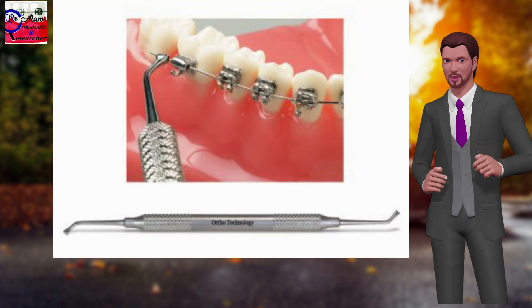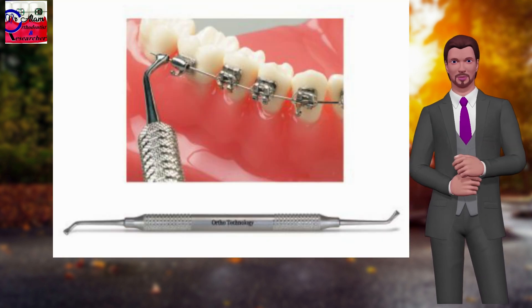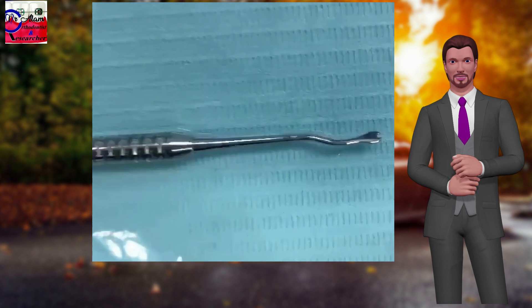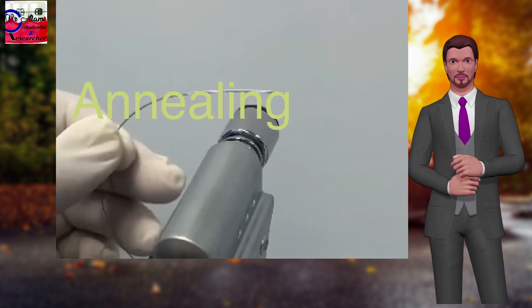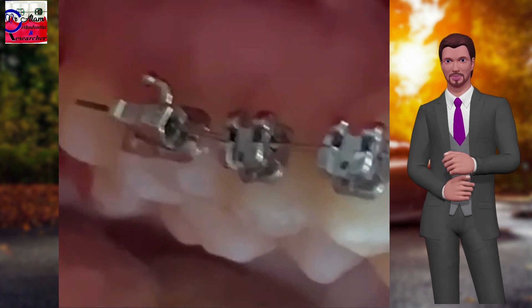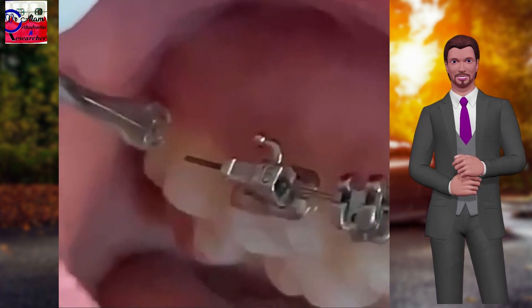Annealing enables cinching of the wire exactly at the distal end of the molar buccal tube. After annealing of the required length of the nickel-titanium archwire, the wire is placed in a buccal tube in the patient's mouth. The wire is cinched with a bird beak plier, weingart utility plier, cinch back plier, or cinch back instrument with tucker.